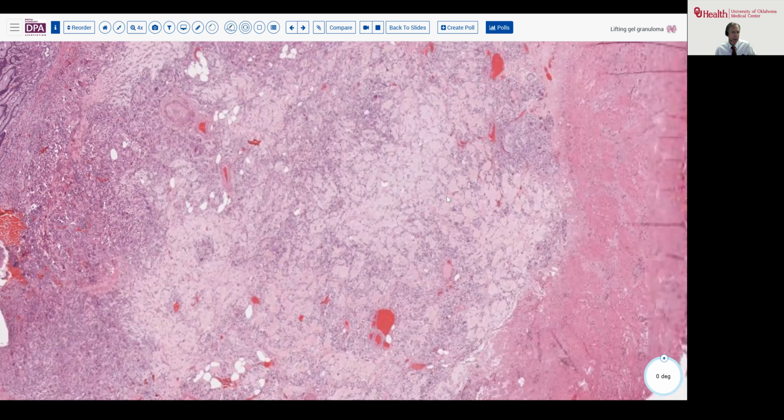muscularis propria. Coming into higher magnification, we see that the bulk of this mass is composed of some eosinophilic amorphous material with admixed intervening cellular elements that show a degree of atypia with some nucleoli and so forth, but there also appear to be some multinucleate giant cells here in this mix of cells.